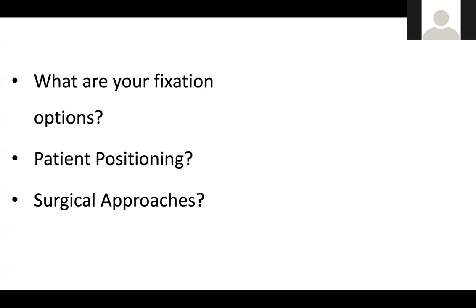The other pitfall is reaming before reducing the fracture. So we have to reduce the fracture first, either using a fracture table or using an assistant to pull. The proximal fragment is the one which is most difficult to control. We have noted that it is in abduction and externally rotated. So we can make use of the freely mobile distal fragment by pulling it to length to reduce the shortening, externally rotating it and abducting it. That can help with the reduction.